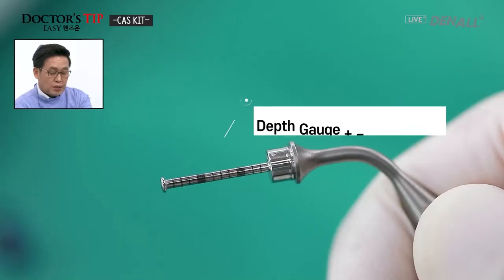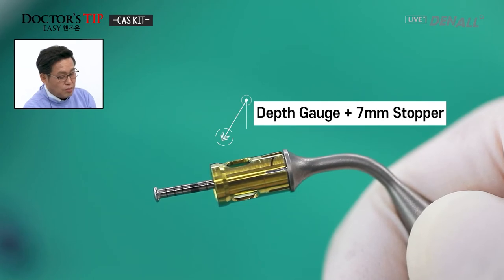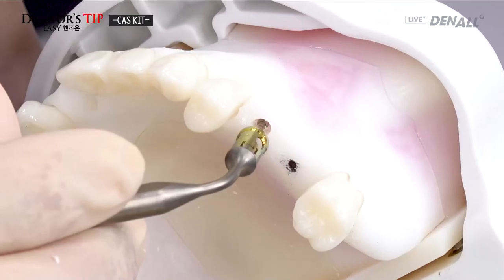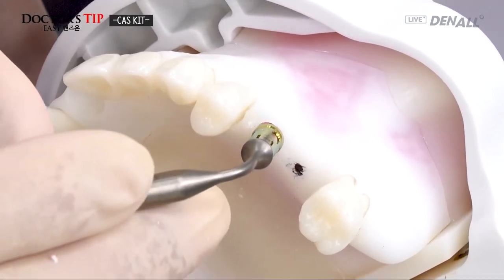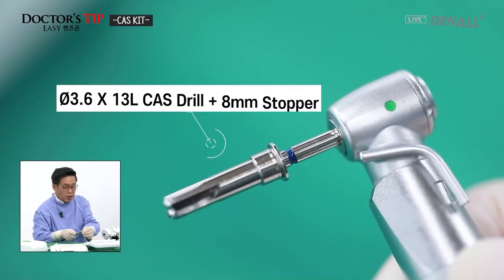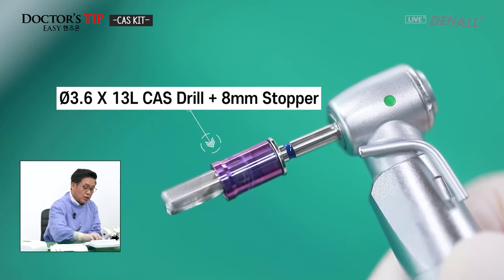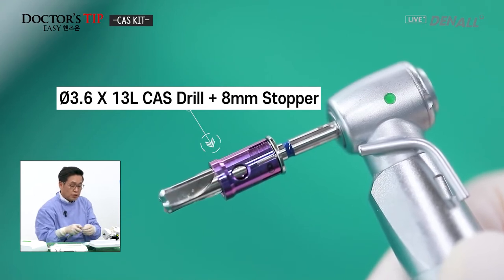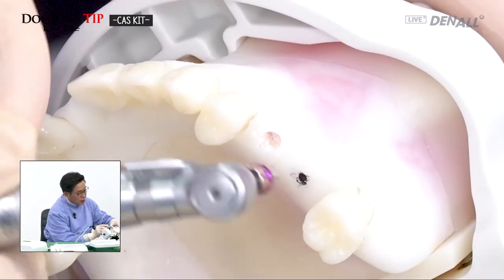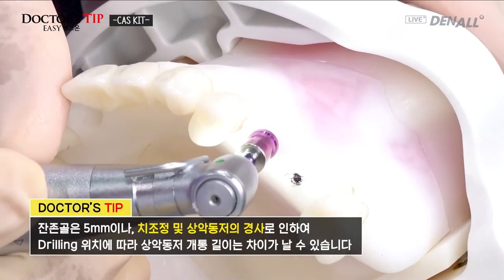Now I feel it is being penetrated. The 7 millimeter stopper is connected to the depth gauge. When it is connected, a 7.6 millimeter protruded portion is observed. The sinus floor is not yet penetrated. We thought it would be 5 millimeters. We use up to an 8 millimeter stopper because the sinus floor is sloped and the alveolar bone itself is also sloped. So the 8 millimeter stopper is used.